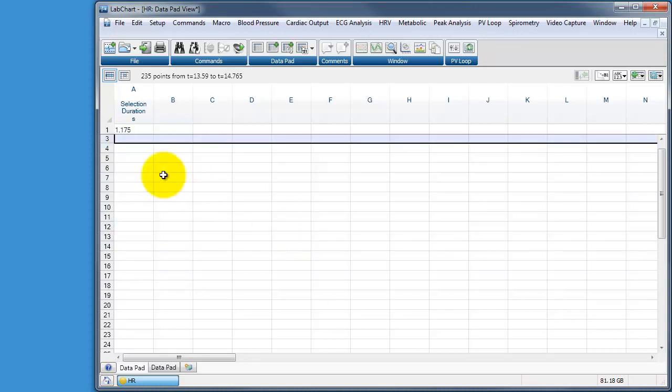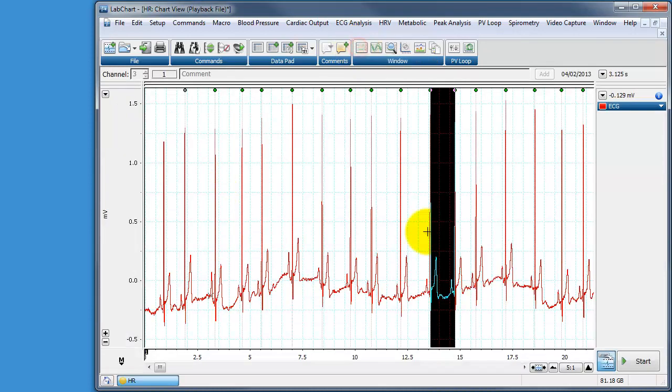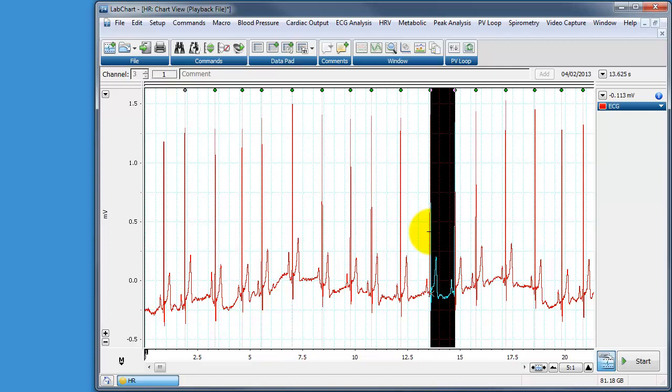I'm just going to delete that so I don't have it in a minute. So that's very useful. We could plot through this entire file pressing control F3, control D repetitively, all the way until the final heartbeat is gone. And that will take a little while. So now we need to kind of get into the mode of macro programming.